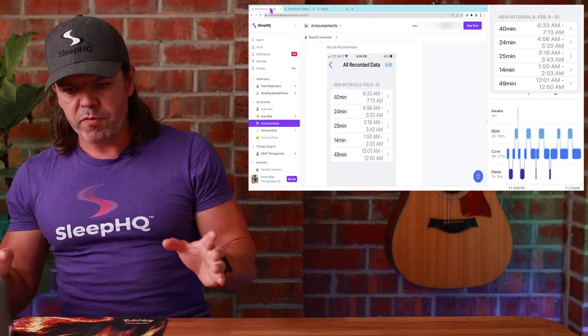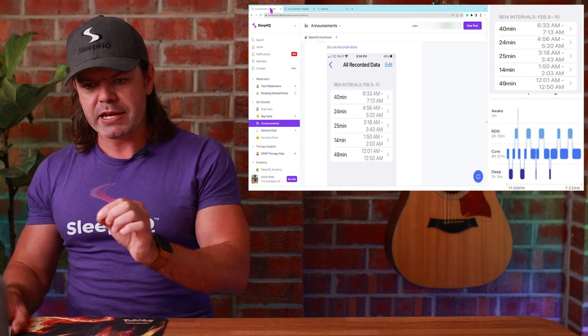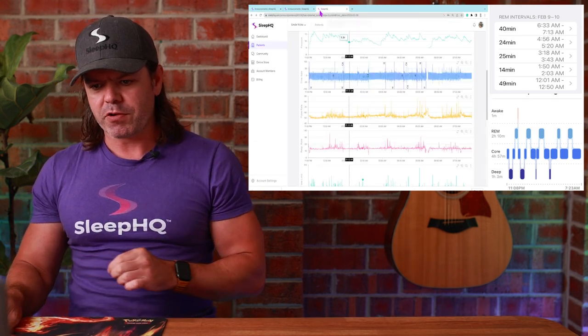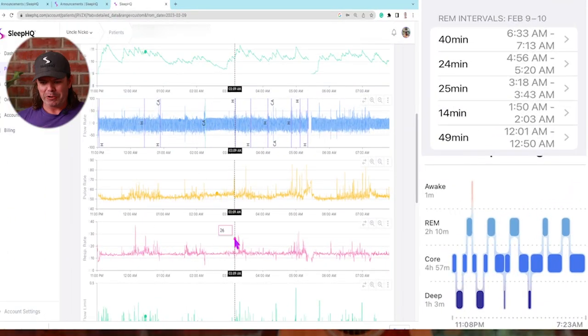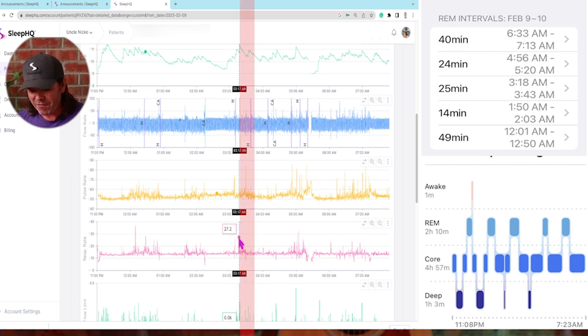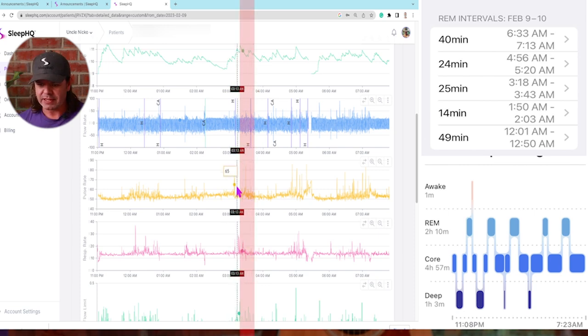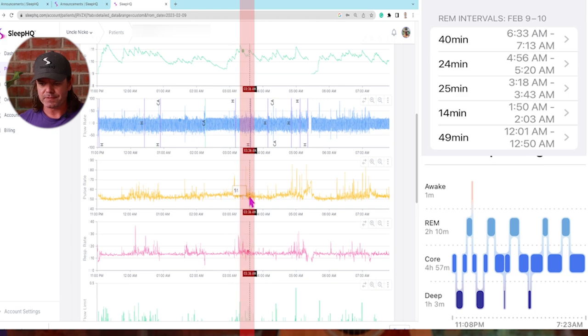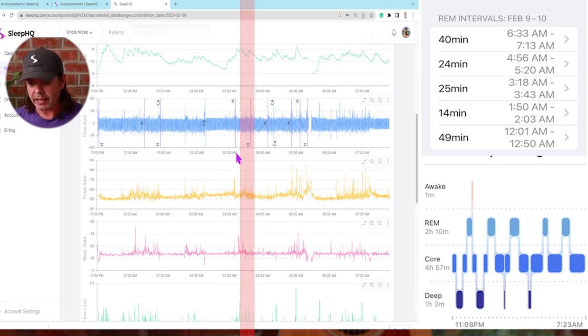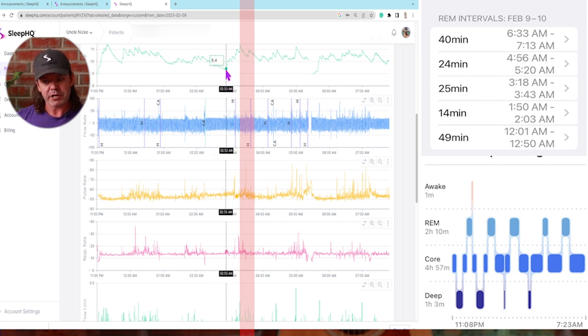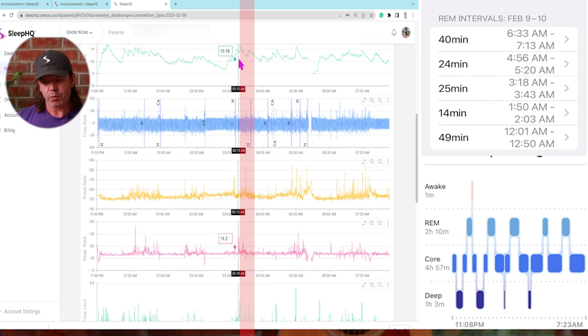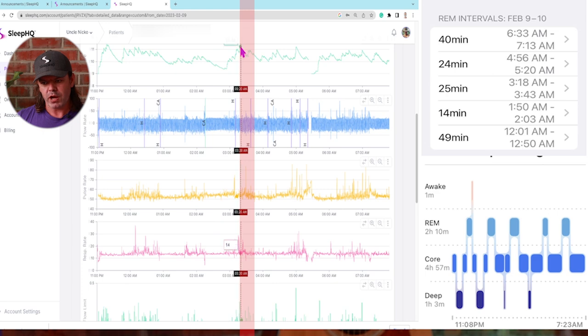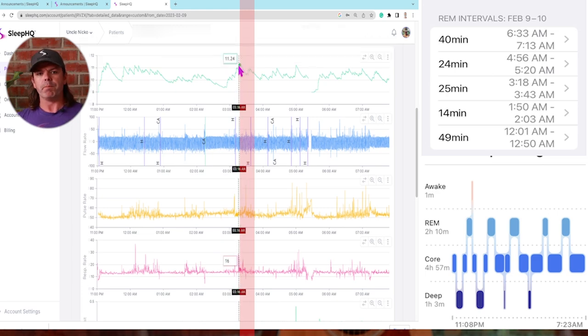Let's go to the next one. 25 minute REM period between 3:18 and 3:43. I don't even need to mark it up. There's 3:18 right here to 3:43. Once again, this period here. You can see it. It's clear as day, clear as night. Check it out. And look here at the pressure this time during this REM period. Have a look at the pressure. 9.42 right up here to 11.36. A big pressure jump.